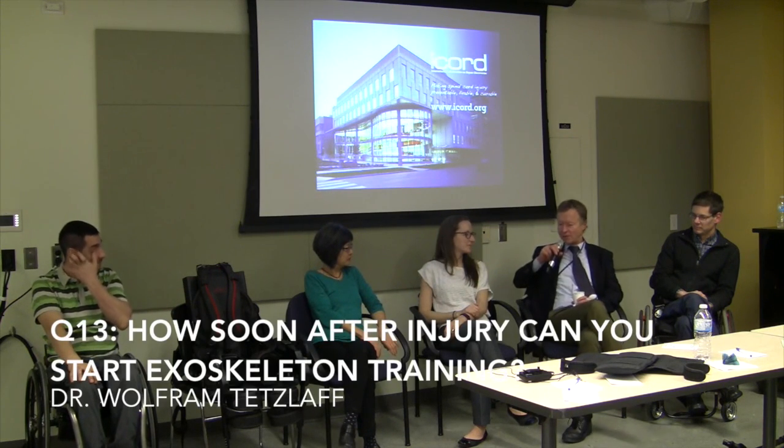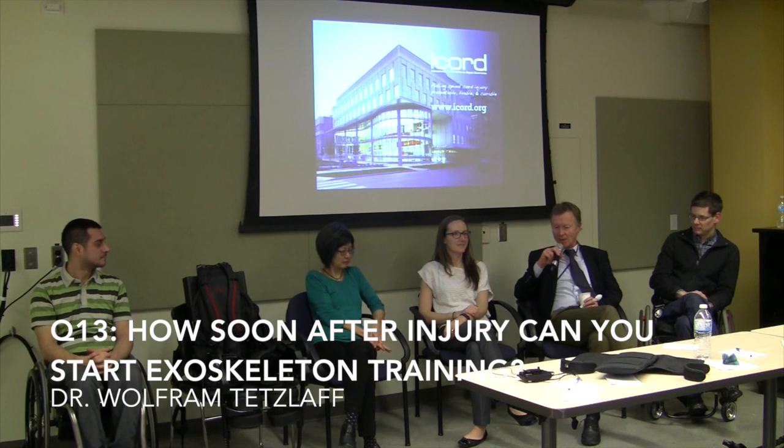It strikes me that when you go through the animal literature and see how many repetitions you need to get good rehab effects, we're not nearly there with these types of devices. We just cannot get up to the numbers of steps that we would need to get close to the benefits we see in animals. What are your thoughts about that? Yeah, in our walking studies, we work towards people getting somewhere in the region of 2,500 steps per session. So I think that is getting close, but that's at the best. They're working up from very low numbers.